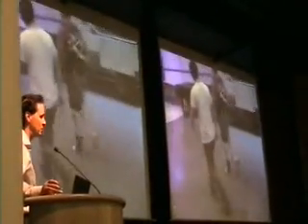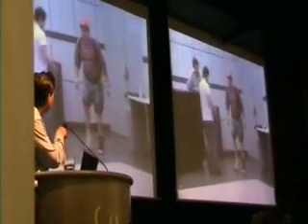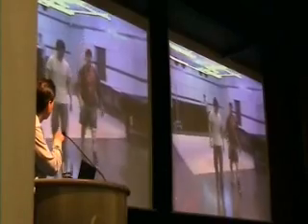In the last few years, we've been developing the world's first robotic foot ankle system. So here, this gentleman put this robot on 30 minutes prior to this video being collected. You can see his face. He's very happy, very confident.